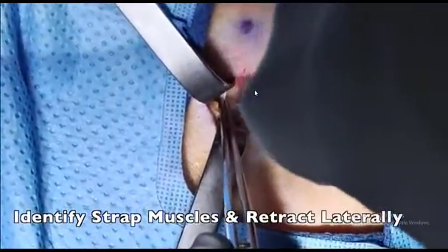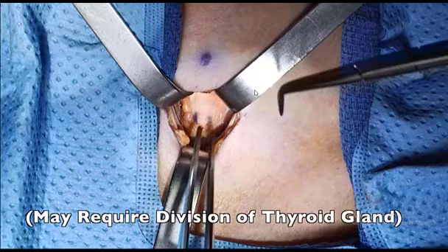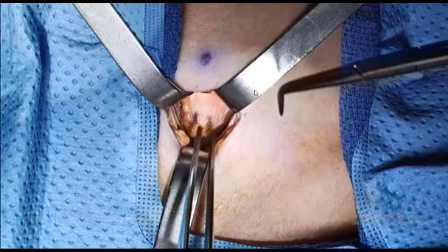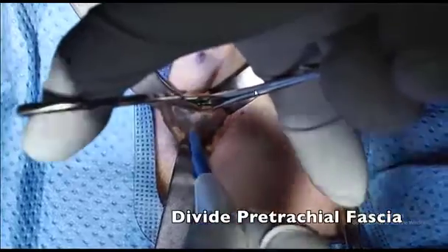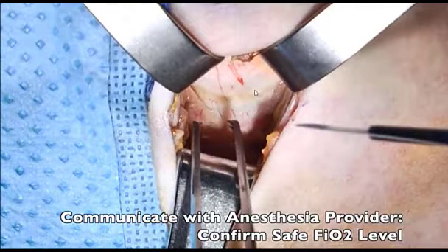The doctor will identify the strap of muscles and retract laterally. So, here they are using 3 retractors. If ever po na makita ni Doc, or if ever na there is a thyroid gland, it is required to at least make a separation or retract it. Again, we will use a cautery. This will prevent bleeding, and at the same time, yung ginagamit dito is cautery pencil para mas maganda ang incision natin.